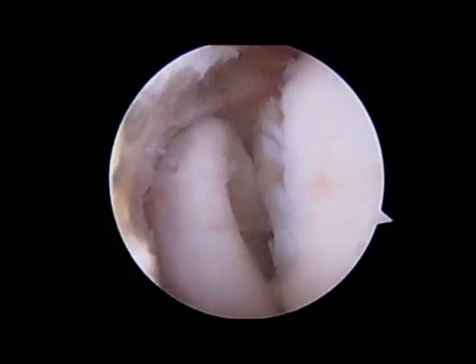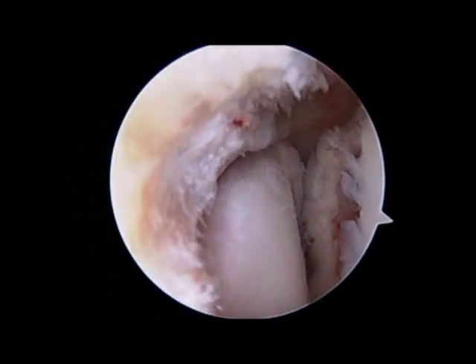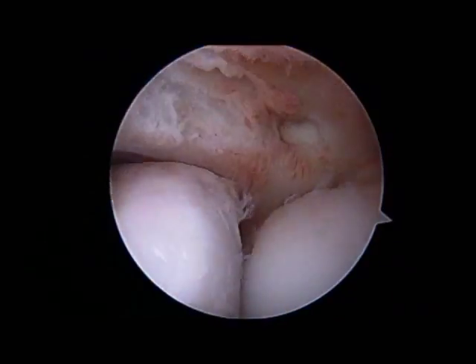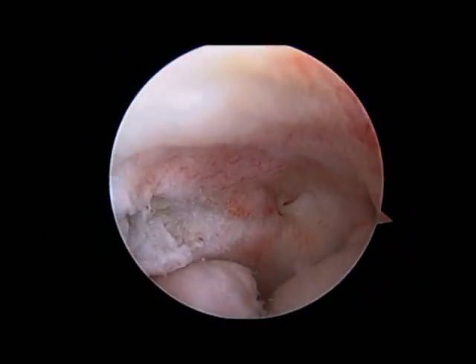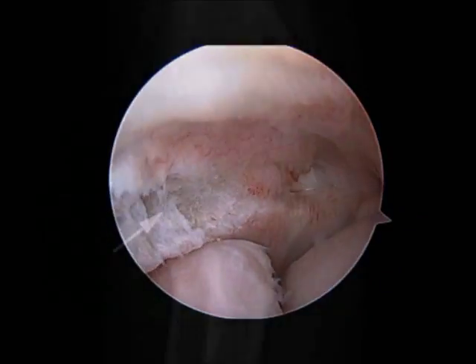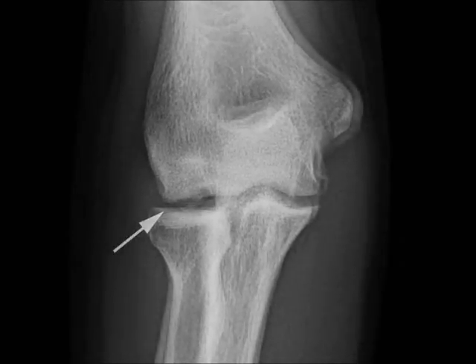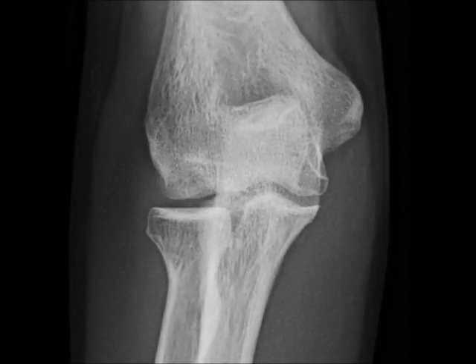At this point the procedure is complete. The patient can move their elbow the day after surgery, shower and wash their arm after a couple of days, and sutures are removed in a week. This is an x-ray of an OCD lesion treated with arthroscopy and microfracture which then went on to completely heal after six months.